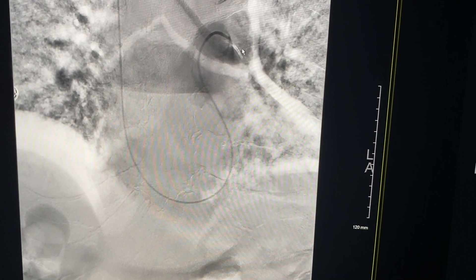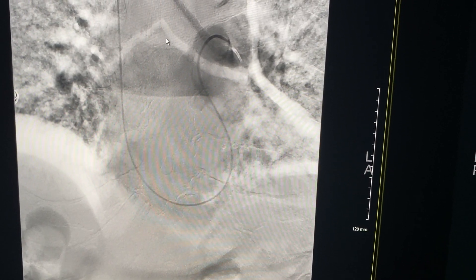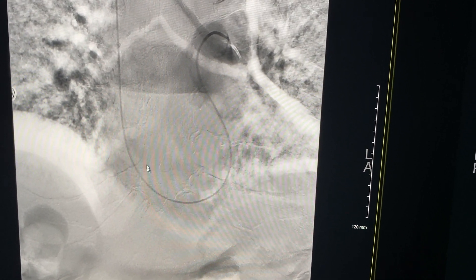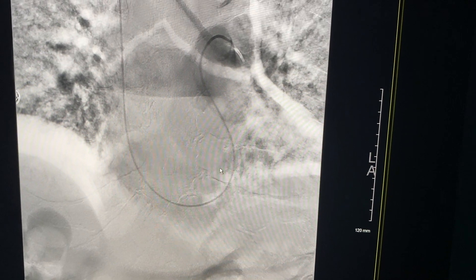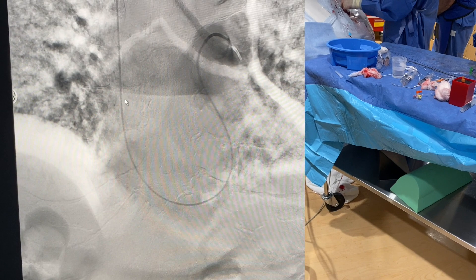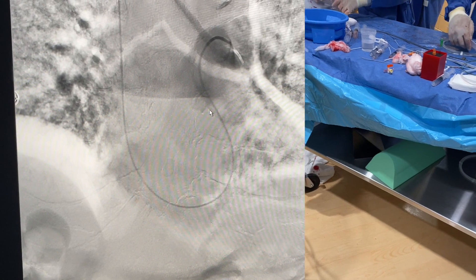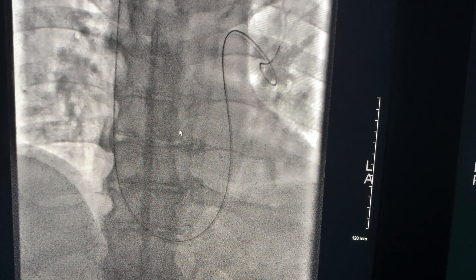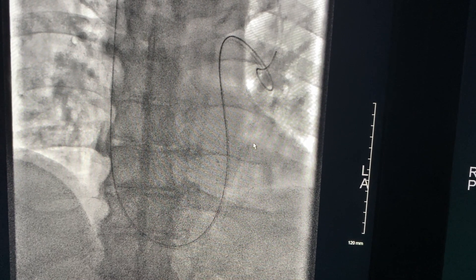The wire now has a choice — it can either go left into the left main pulmonary artery, which had a little bit of clot, but the main clot we wanted to get out was on the right side. So we had to manipulate the wire and get it onto the right side. While you're in the heart, it's very easy to cause damage and irritate the lining of the heart, causing various arrhythmias — so this is a pretty high-risk procedure. But as long as you're taking your time and being meticulous and careful, you're able to cross across the heart. Right now we're in the left main pulmonary artery, but the goal is to get into the right side.